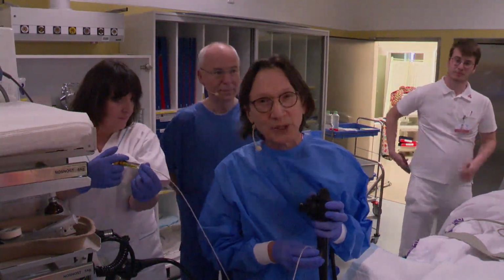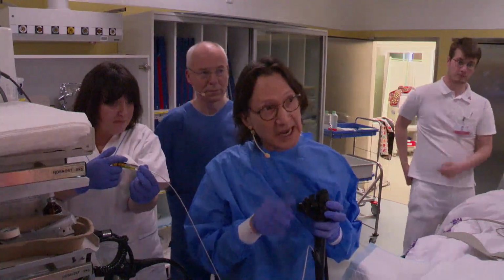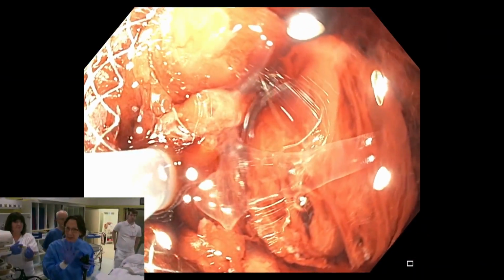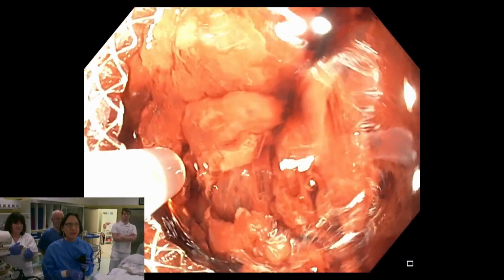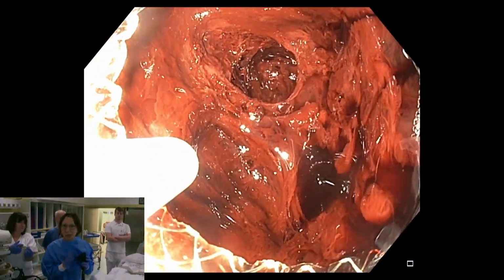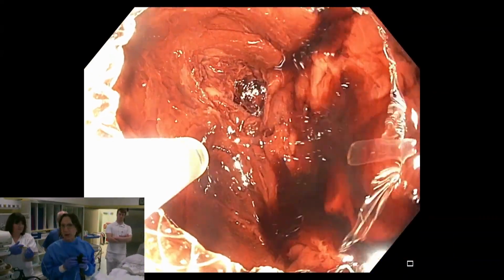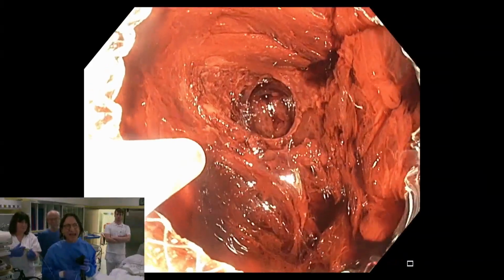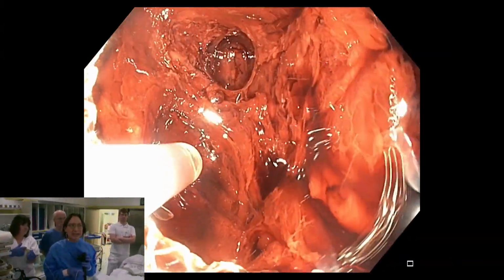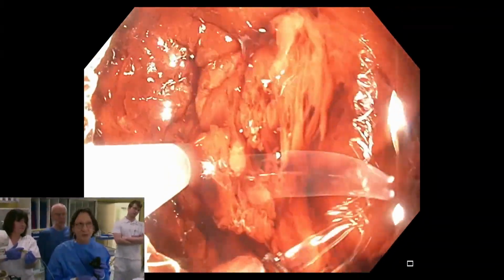Pass the therapeutic gastroscope through the 20 millimeter Axios. And here you see the interior. I'm being very careful with gas. Even though it's CO2, you want to be very careful. And usually I do this underwater, but I want to demonstrate for you how we can apply what I call the magic gel. It's Purostat. So this is the 3D self-assembling protein that has hemostatic properties, but also tissue regenerative properties.